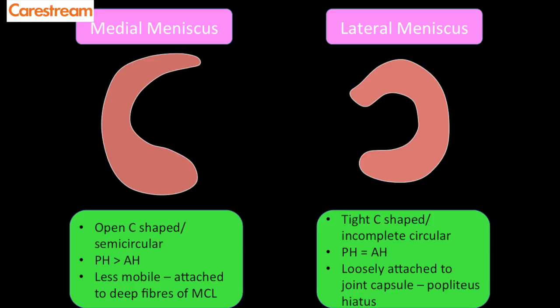The medial meniscus has an open C-shaped or semicircular appearance. Importantly, the posterior horn of the medial meniscus is larger than the anterior horn — nearly double its size. Whenever there is a displaced meniscal flap, the posterior horn will appear attenuated or smaller. If the posterior horn appears the same size as the anterior horn, you know there is a tear, because the posterior horn of the medial meniscus must be nearly double the size of the anterior horn. The medial meniscus is also less mobile because it is attached to the deep fibers of the medial collateral ligament, making it more prone to tears.